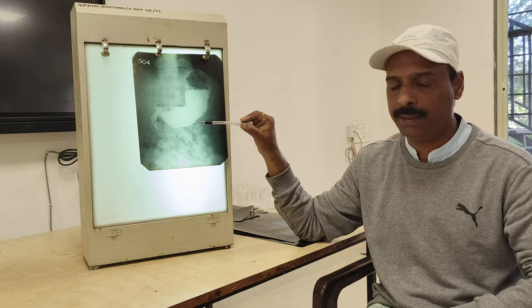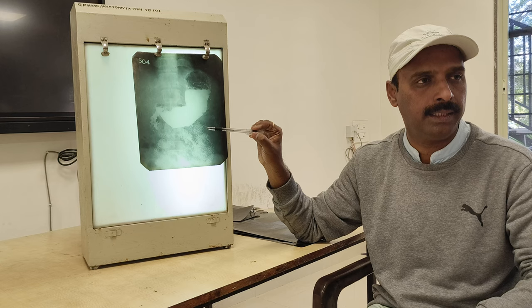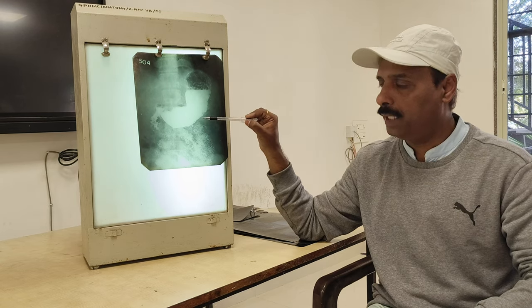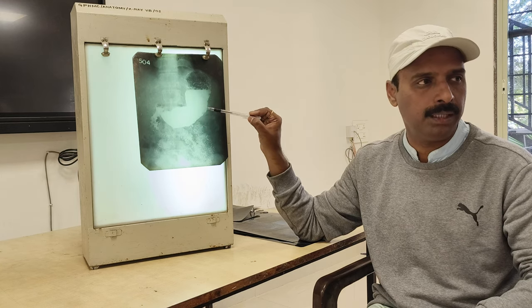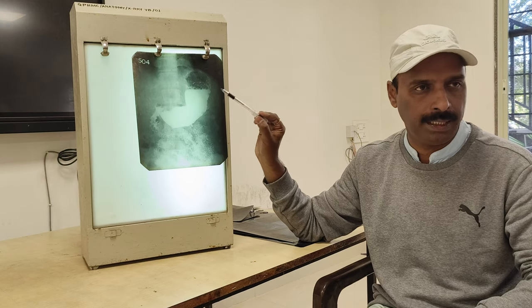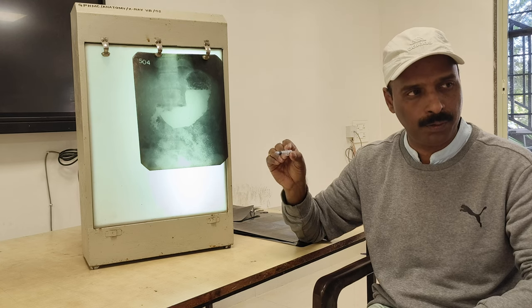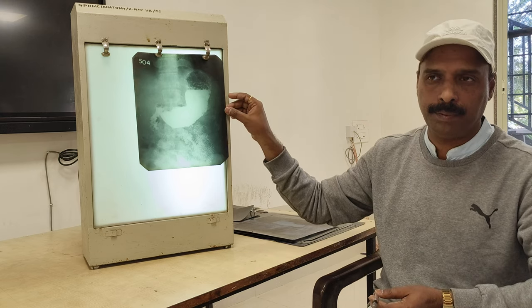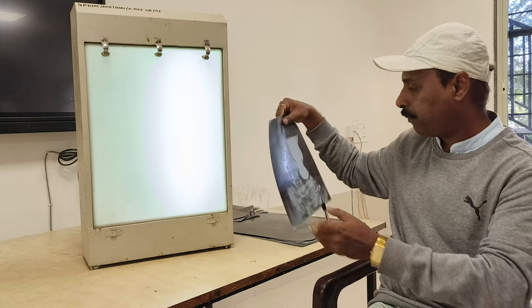If the outline marking is interrupted, then there may be a chance of a gastric ulcer. We get a gastric ulcer where there is a filling defect or an interruption in the continuity of the line. That is what you have to remember in the barium meal. So, barium meal x-ray, what is barium follow through, what is the x-ray you have to identify. This is a very important special, contrast variety of x-ray.